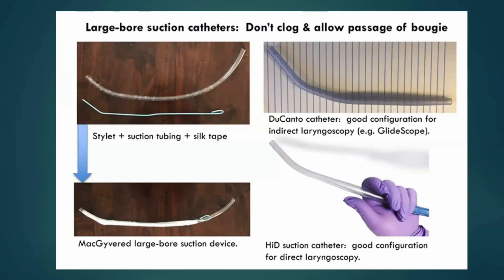More often than not, it won't actually suction through something with a smaller hole. And if you have gastric aspirates, there's potentially going to be bits of food, and you have large volumes of this fluid as well. That's why it's a drowned airway. So you need a large bore catheter to physically suction everything out.